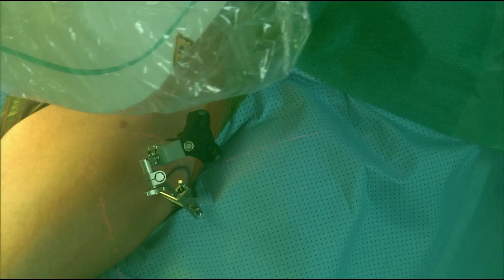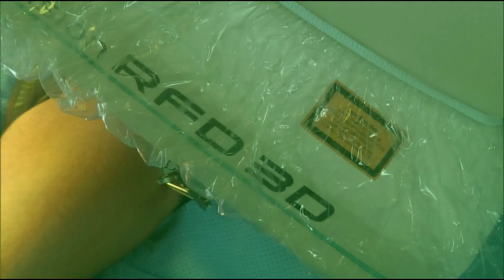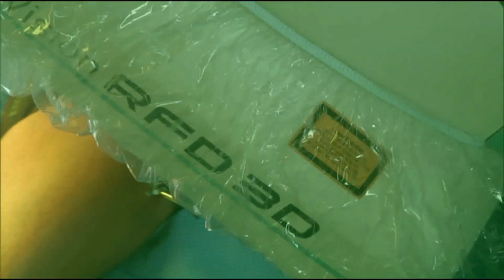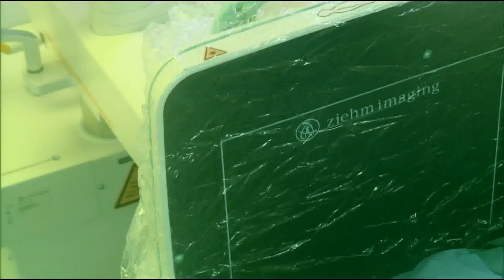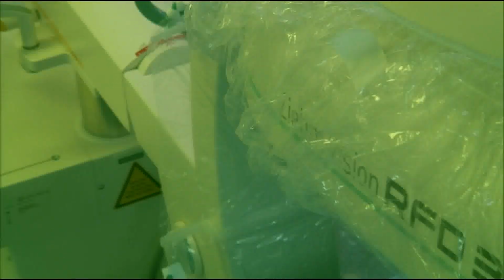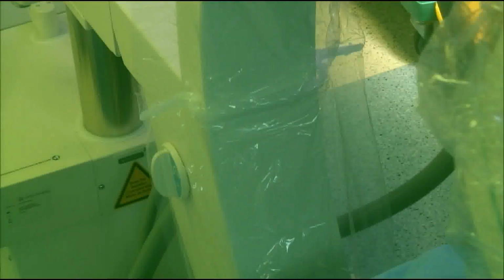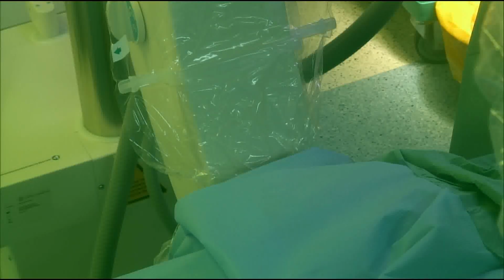Once we finish our patient registration and establish the accuracy of our digitalization process, we move to the 3D scanning of the bone of interest. We use a Ziehm 3D scanner because it's compatible with the Stryker navigation system, and we scan an optimal amount of the bone, so some of the bony landmarks will act as a cross-check for our navigation system. This process usually takes around 8 minutes or so, and it's ideal for all the staff to leave the room to reduce the amount of radiation exposure.